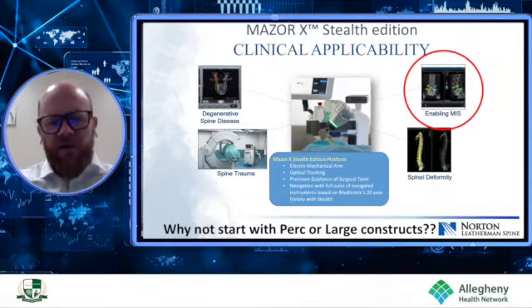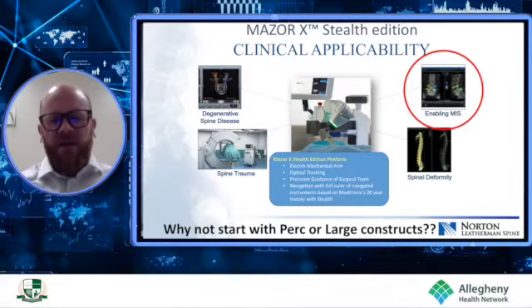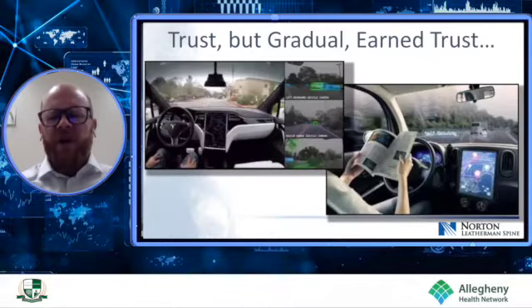So Tesla is a great analogy. When I give this slide, I ask how many people in the audience have a Tesla? About half the audience now raises their hand. It's crazy. So then I ask, how many people use the autopilot to drive home? Nobody. Nobody gets in a car they've never driven, hits a button and lets it drive home, right? You learn the car, you trust it, you drive it. So why would you do that with a new technology in surgery, right?